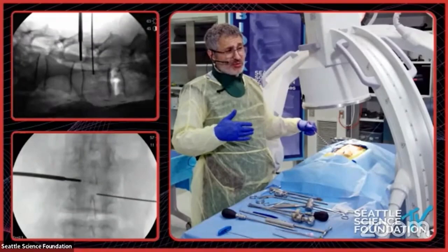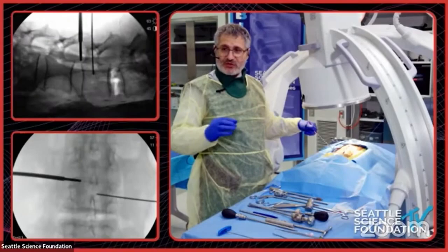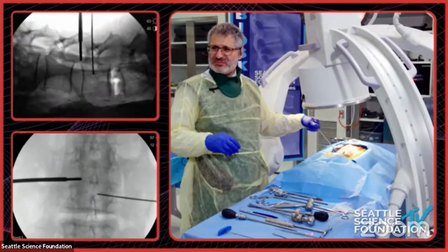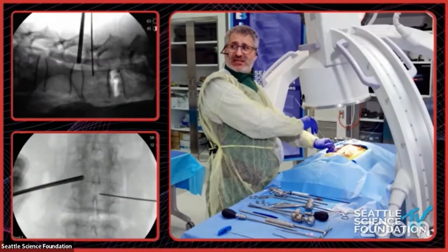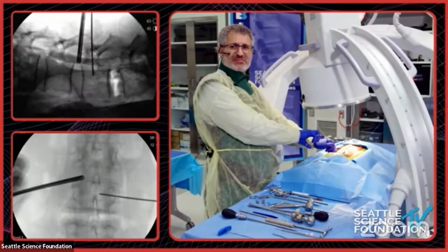I'm positioning more and more toward the Kambin's triangle while stimulating. This is a typical entry point for Kambin's triangle — it is more medial than most people realize. The angle can be 45 degrees more or less. At this point I have to choose: do I want to go all the way to the other side to place the cage on the epiphyseal ring exactly on the other side, or do I want to put it in the front of the disc space? I can truly choose by starting point and angle where I want to end up. I stimulated at 4 milliamp, the sleeves go down, the probe comes out, and the K-wire goes in. Before I poke in, I make sure I get another X-ray. I use extensive use of a Kocher.